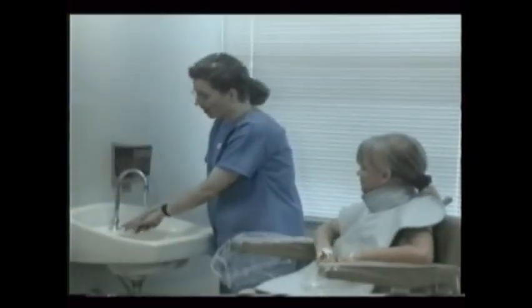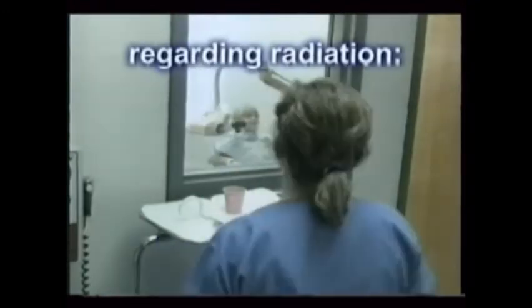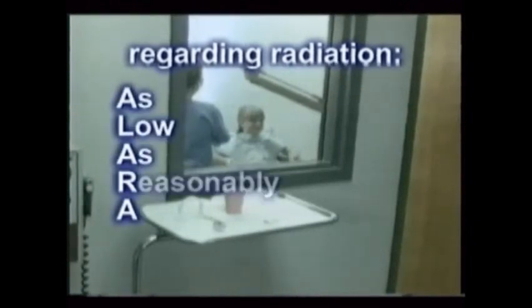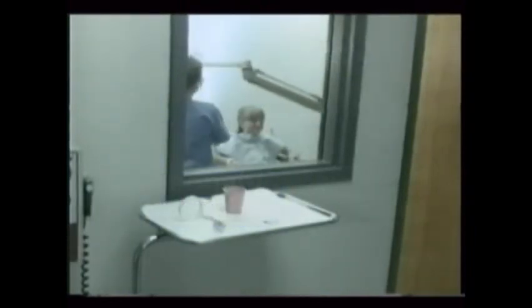By understanding the flow of dental radiography and the purpose and importance of each and every step, and through a lot of practice, you will develop the skills to confidently provide dental x-ray exams for your patients. Don't assume that you can always simply just take another x-ray — remind yourself who suffers from that attitude. The patient does. A rule known as ALARA — As Low As Reasonably Achievable — must always be borne in mind when x-raying patients, thereby minimizing their exposure to radiation.